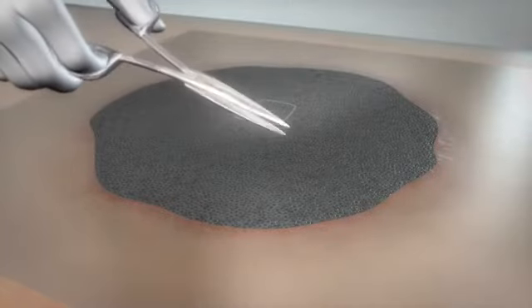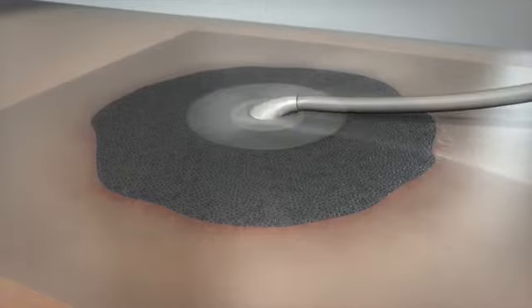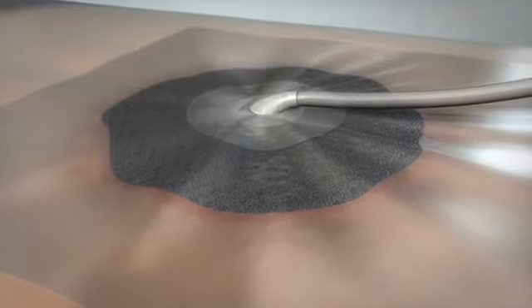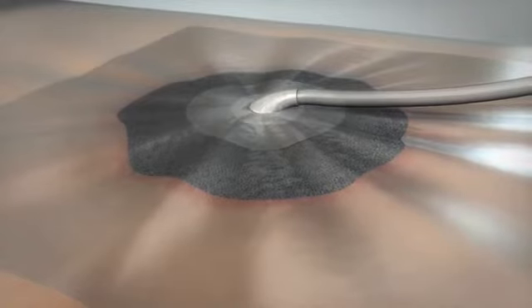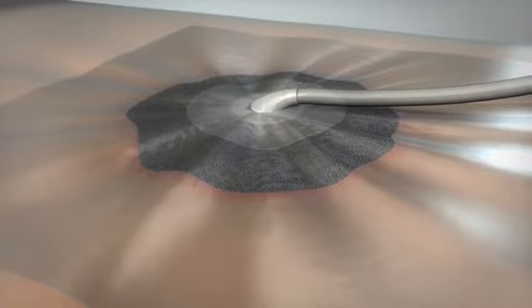The proprietary TRAC pad and tubing are then applied to the drape and provide the connection to the therapy unit. In combination with sophisticated software, TRAC technology helps provide uniform negative pressure to the wound surface. It also provides alarms when there are conditions that would impact negative pressure wound therapy.